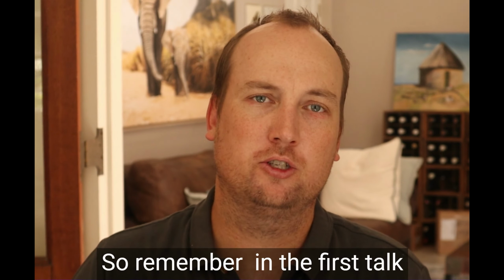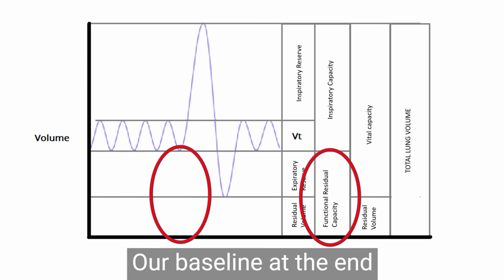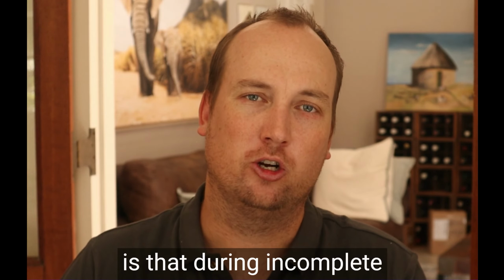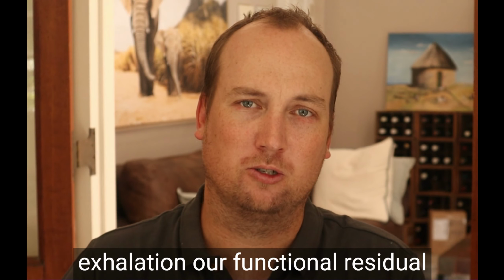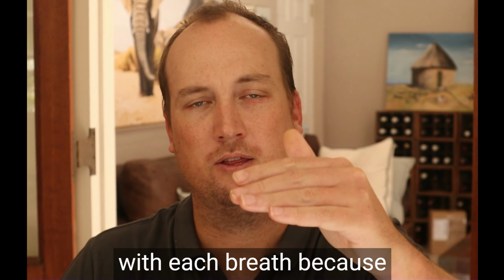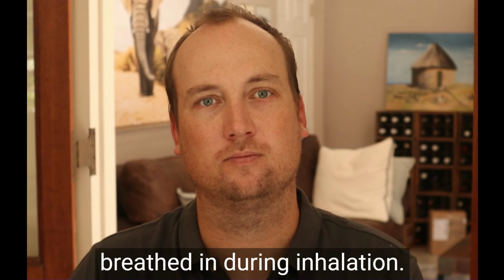So remember, in the first talk we spent quite a lot of time going through the fact that baseline is not zero. Our baseline at the end of exhalation is our functional residual capacity. And now what we're saying is that during incomplete exhalation, our functional residual capacity, or the volume that is in the lungs at the end of exhalation, is slowly increasing with each breath, because each breath fails to exhale the same amount of air that was breathed in during inhalation.